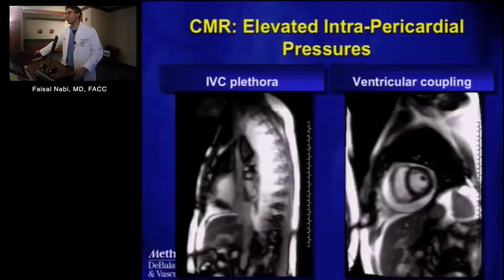With real-time imaging, we can actually watch the heart behave inside the pericardial sac. Do you see the heart swinging in the pericardial effusion? That would be a marker of electrical alternans, or the cardiac oscillations that you would see. We can also see, as the patient inspires and expires, how the interventricular septum behaves with the ventricular coupling.